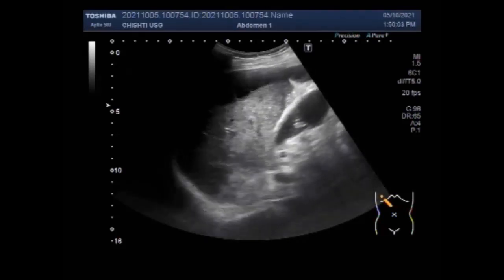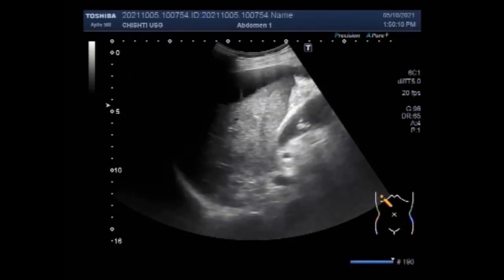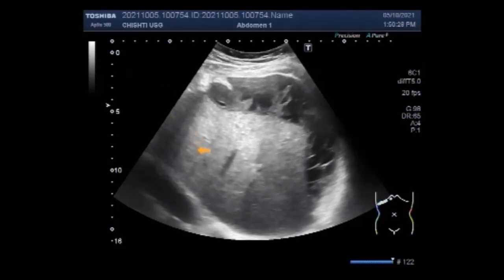We defined sealed perforation as a colon perforation with localized abscess identified on operative computed tomography or pathological findings, with no evidence of free perforation, including fecal contamination and dirty fluid collection in the peritoneal cavity. You can see the fluid is thick and turbid, and multiple internal opacities are seen along with small adhesions. And adhesions are always found due to the increased thickness of the fluid and multiple internal echoes in the fluid.